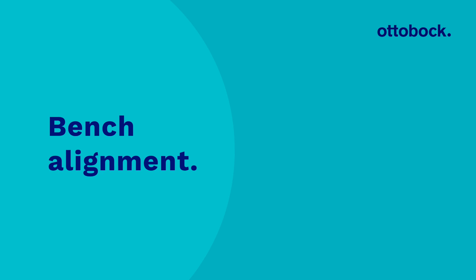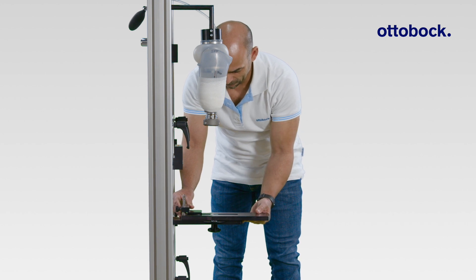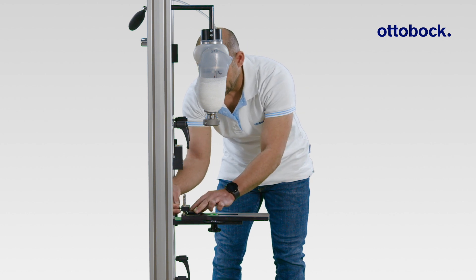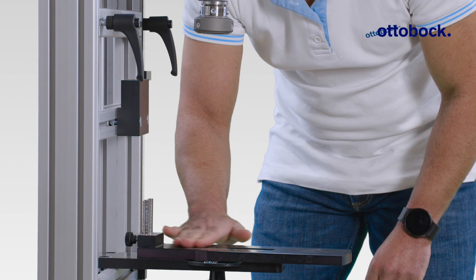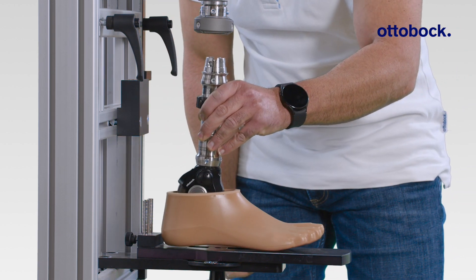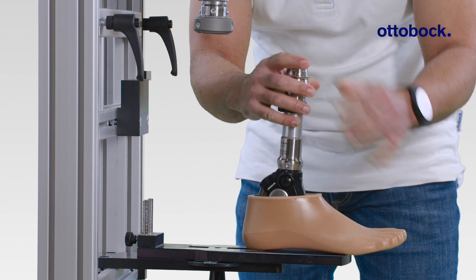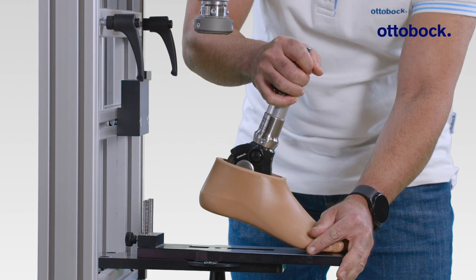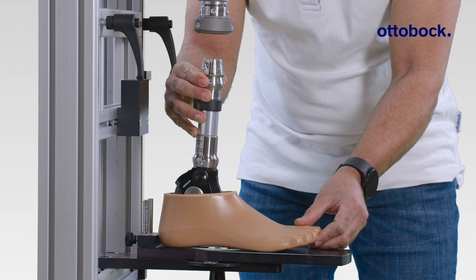For the bench alignment, observe Ottobock's general alignment recommendations. This video shows the specifics of the Taleo Adjust using the transtibial alignment as an example. It is important to lower the heel height plate to zero, align the foot without a shoe to allow barefoot walking, and make sure the Taleo Adjust is at maximum dorsiflexion. Also do this when following knee-specific alignment recommendations in the case of transfemoral prostheses.